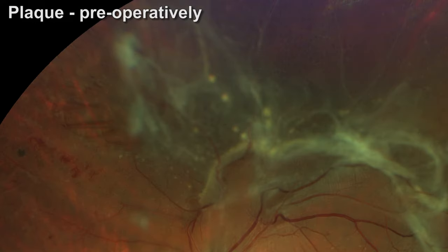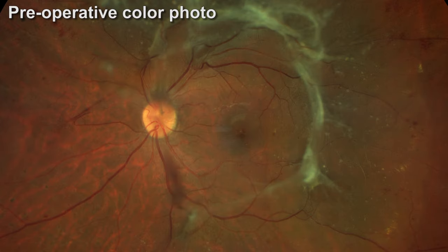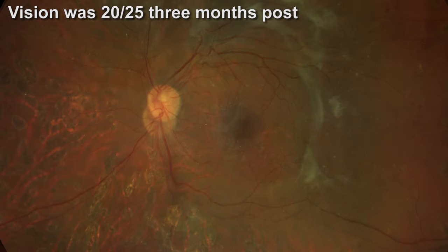There's the area of peripheral traction that you'll see in the preoperative photo, and then postoperatively the area settled down nicely. This patient did well. Over 50 percent of patients do well with surgery, but some people can lose vision.